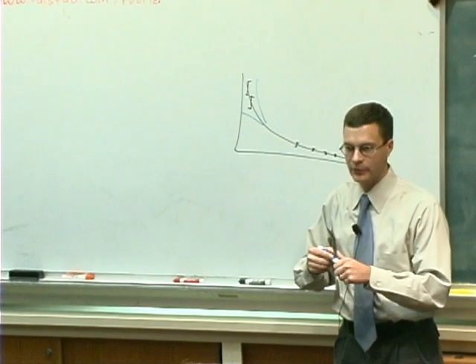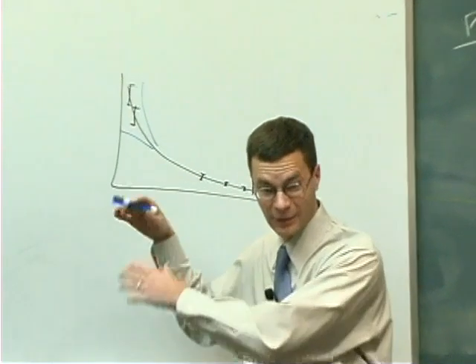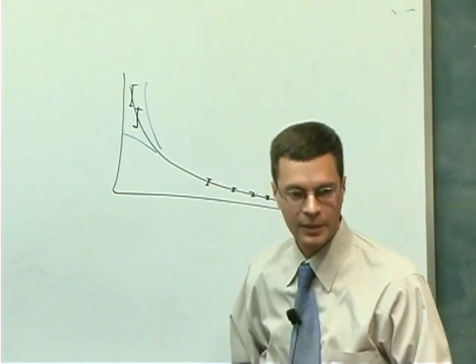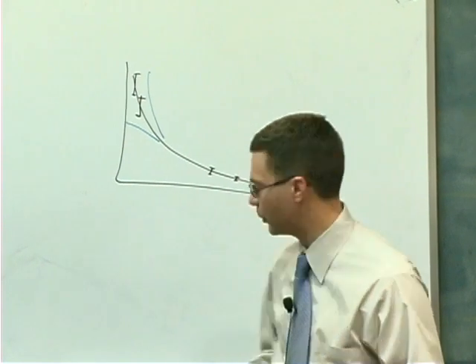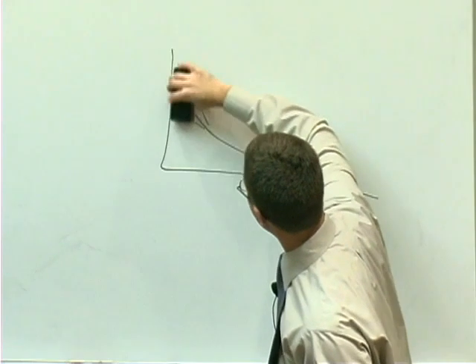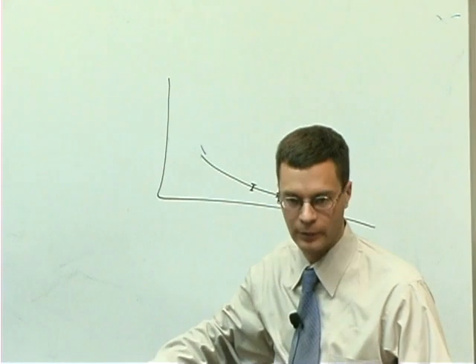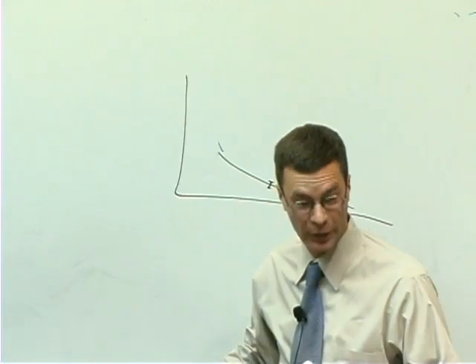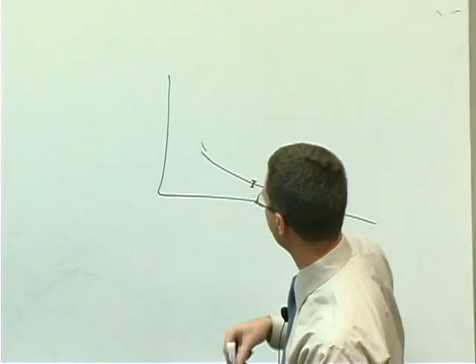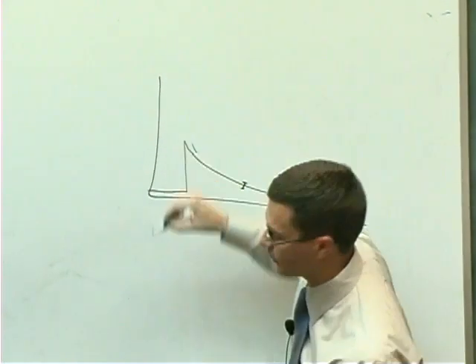Okay? So what that means is that our statistical model won't do as well in making this correction for experimental designs that are at this very low frequency, or correcting for this very low frequency. So that has led to the practice in the analysis of BOLD fMRI data of doing digital filtering to try and remove low frequencies from the experiment. Because number one, there's a lot of noise at those very low frequencies, and number two, we know we don't do a very good job of modeling them with these techniques that I've described so far. The safest thing to do is just to digitally remove them by filtering the data to set the power at those low frequencies to 0.